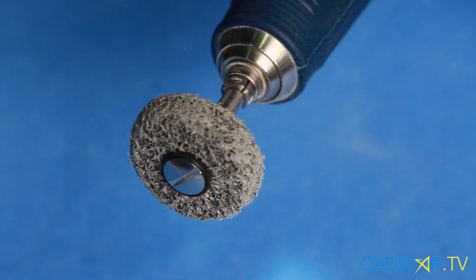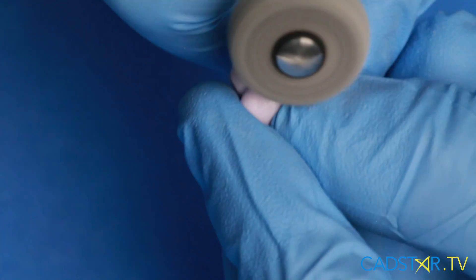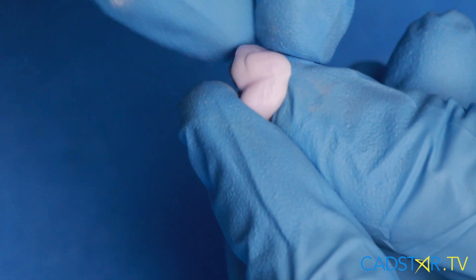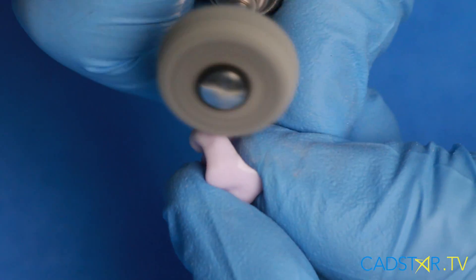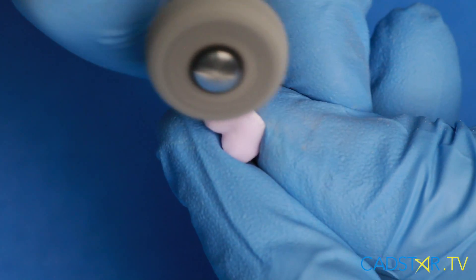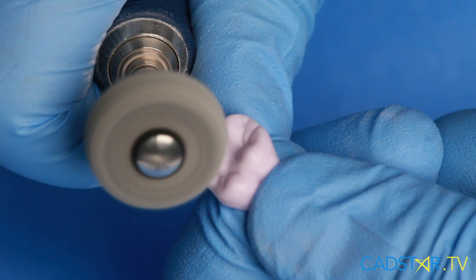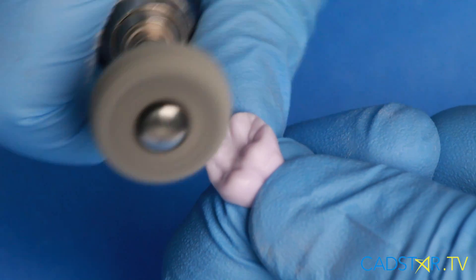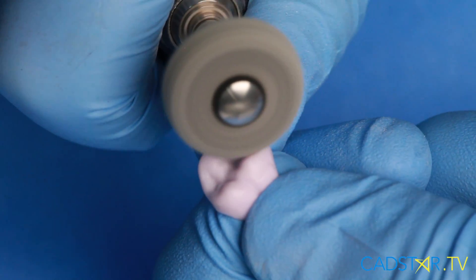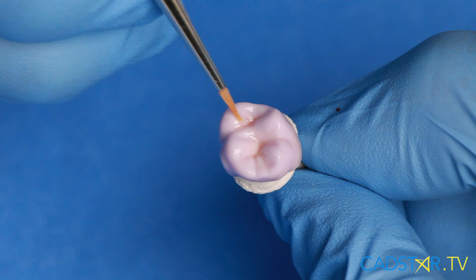The Diamond Twist by Premier provides a nice finish to my Emax surface before I add the glaze. What I want to do is remove those little scratches that come from the milling. I like it better than polishing wheels. As you watch how it's being used, I stay away from the proximal contacts because I don't want to remove the proximal contact force. Emax in the intermediate phase is more like a chalk — it's a hard chalk. The Diamond Twist is where I really take that surface texture and make it smooth. As a result, I can place a thinner viscosity of glaze even when I'm brushing on using the accelerated cycle, and I do not see bubbles.